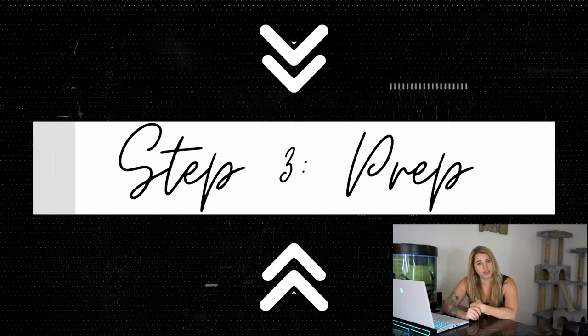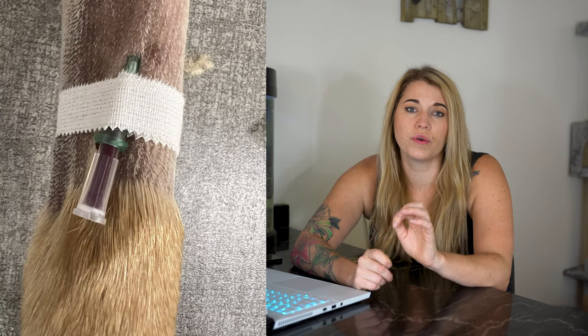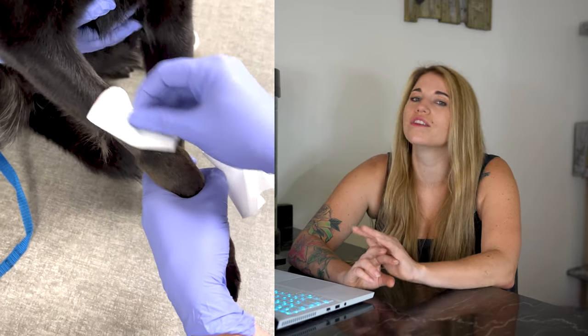Step three is preparing your site. I personally like to shave all the way around for patients that are getting hospitalized, as it makes the catheter easier to remove later. If a patient is just undergoing a quick sedated procedure, you may just need to shave a little square in the front of their leg. The most important thing is that you're shaving enough room so that the hub of your catheter will fall within the shaved zone. After your shave, the skin should be aseptically prepped with your hospital's protocol. If you need to palpate for the vessel, try to do that before you prep so your field stays as aseptic as possible.